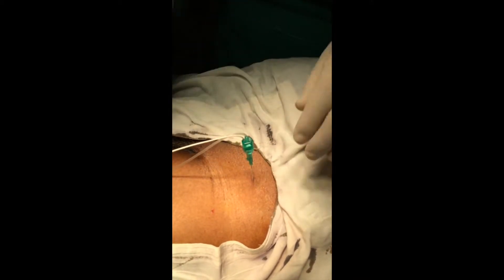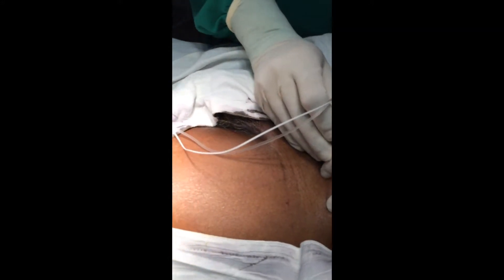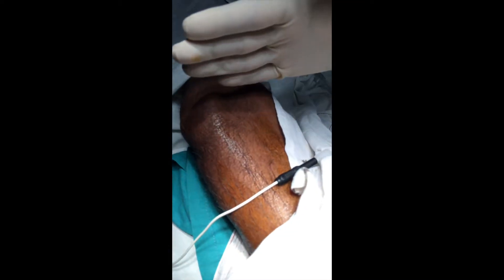Iliaca. Now we are getting patellar twitches — dancing patella. Asking the assistant to decrease the current from 1 milliamp. Unfortunately not getting twitches at 0.6 milliamp. Now I'm redirecting the needle and slightly inserting it deeper, and I'm getting excellent patellar snap — dancing patella.